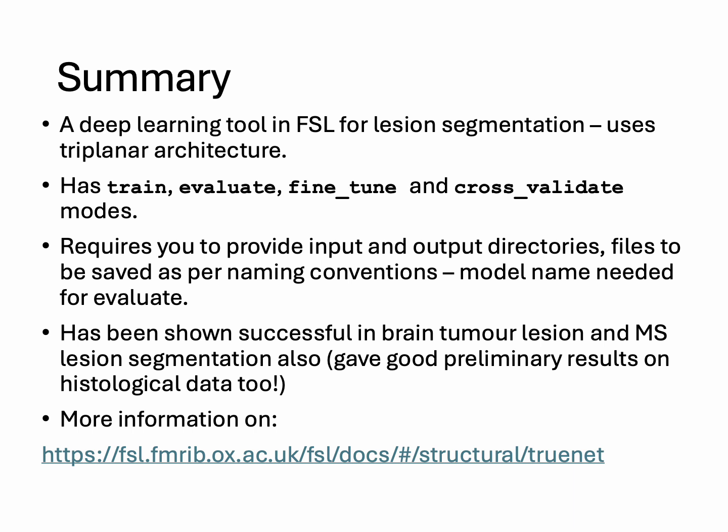I have not included them here, but it's a very versatile tool. You can train for different applications. And we have more information available on the FSL documentation page. The link is provided here. Please feel free to check it out for more advanced options and also some of the recommendations and suggestions we have regarding using this tool, right?